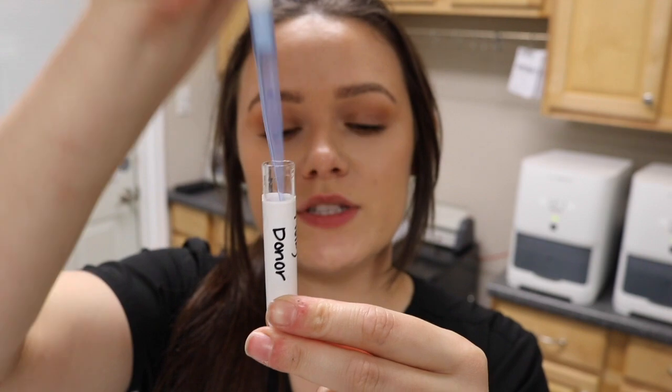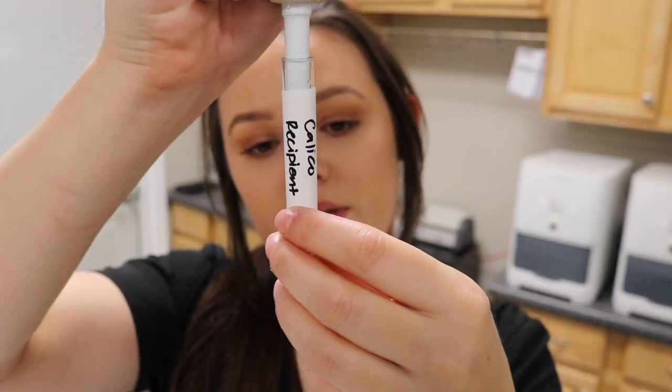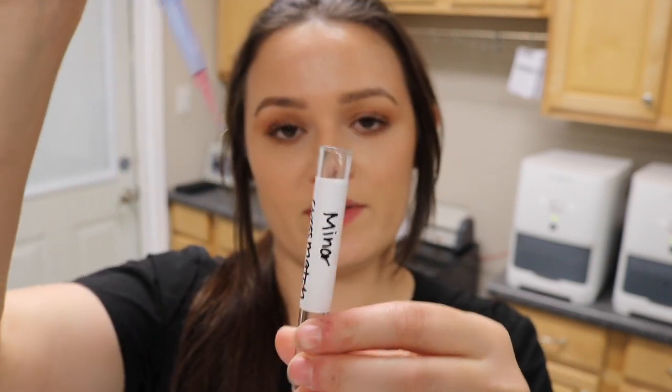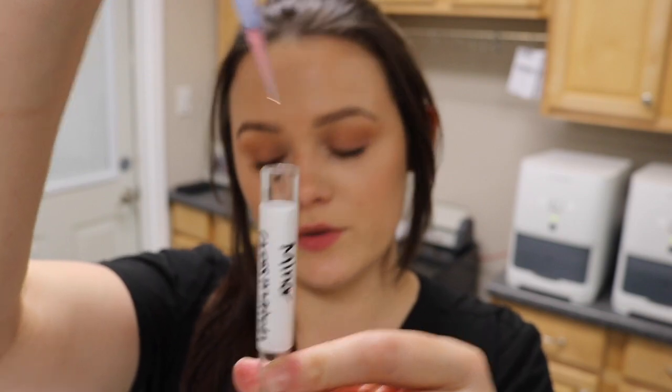For the minor cross-match, I'm going to take two drops of the donor's serum and two drops of the recipient's cell suspension. I'll add two drops of donor serum, change my pipette tip, then add two drops of the recipient's cell suspension into the minor cross-match tube. I'll invert it gently and set it aside.